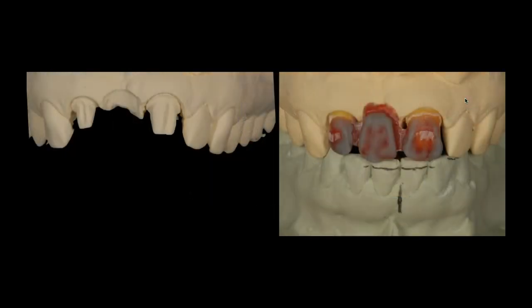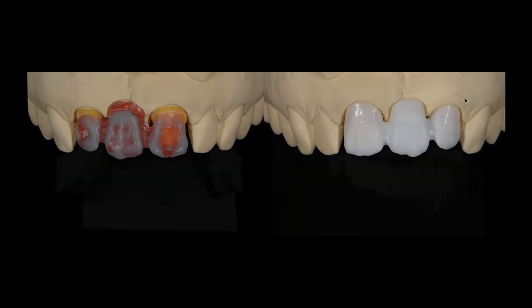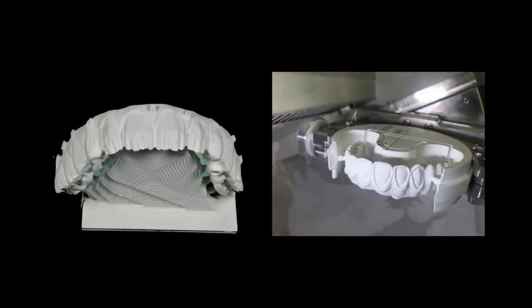So again, no matter what the frame is that I'm doing, I'm always looking to support my framework to make it proper for the light absorption of the restoration. Now, I know that seems a little funny when we talk about it this way, but I'm getting to the point where my layering is getting better, or easier, should I say, because we're utilizing our substructure materials, especially zirconia these days, to do more for us. So the ability of our milling machines to actually give us more detail becomes really critical for me.